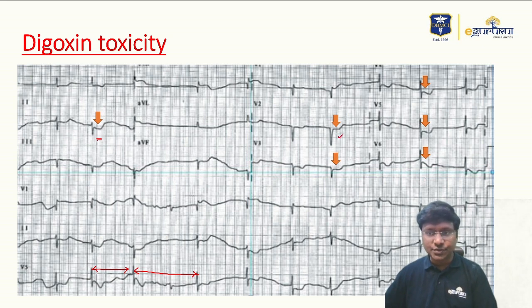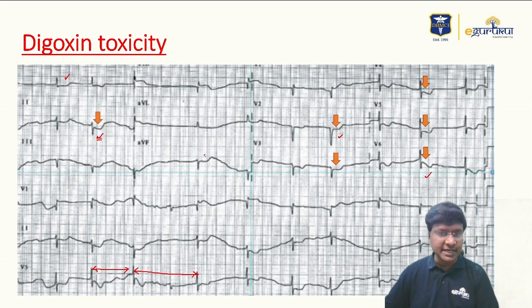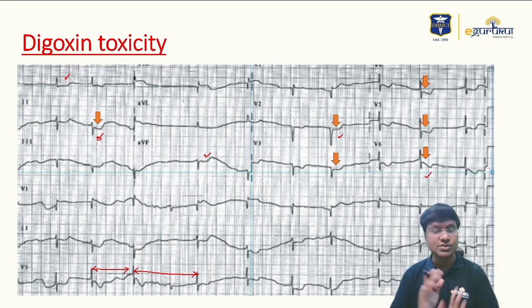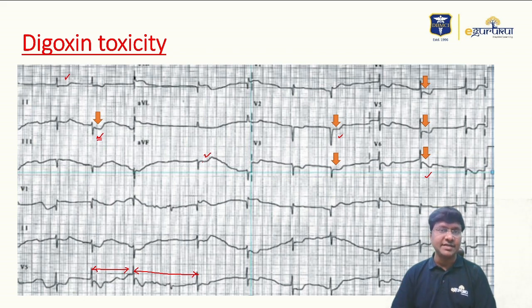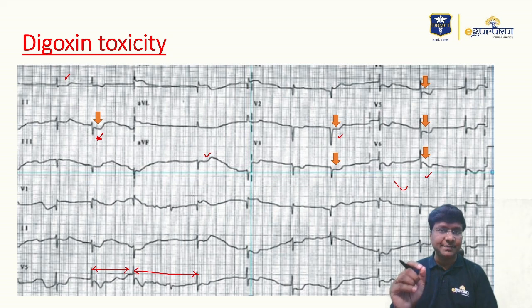You can see ST segment depression all the way from V2 to V6 — that is V2, V3, V4, V5, V6 — and also in leads I, II, and aVF. ST segment depression is present in more or less all leads. You should observe the shape of that ST segment depression carefully.